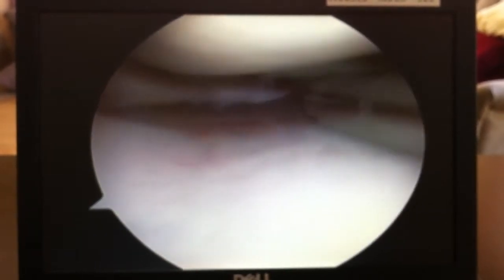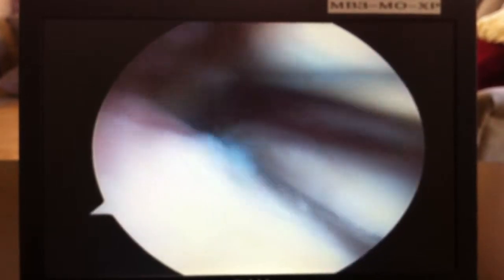And so I'm going to use this little shaver here. There's a piece of this flipped way over there as well. And what I'll do is take out the torn piece here. Try to save as much as we can. We have to get back to a smooth, stable rim and a stable transition to the remaining rim of the meniscus. This part here should be the piece flipped out of the joint — you can see that piece. I want to get that with a full-radius cutter.